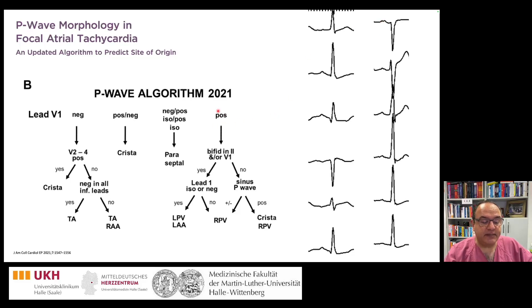Going back to the algorithm, V1 is positive, so the next step is to look at V1 or lead 2 to check for notching in the P-wave — and this is exactly what we see here in V1.